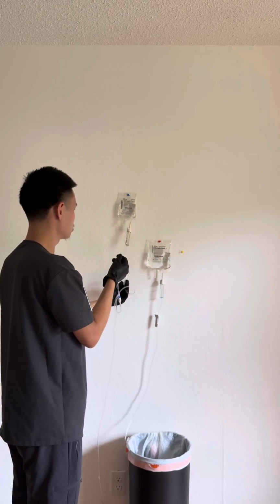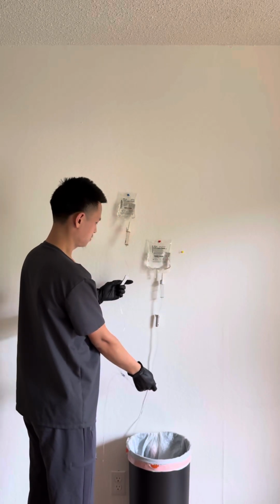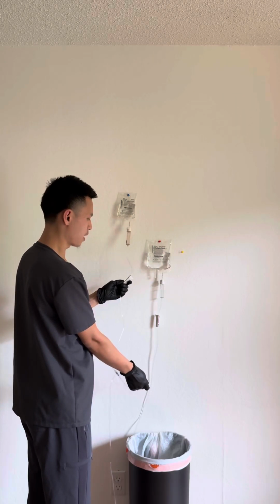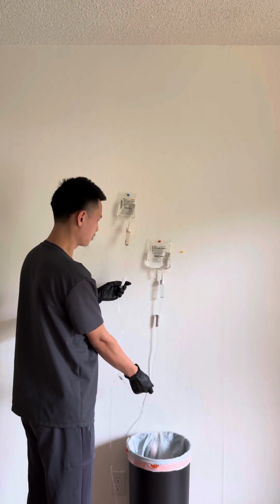And then I am going to prime it. I will roll the roller to the wider side so that fluids can come out, so that the tube can be primed.